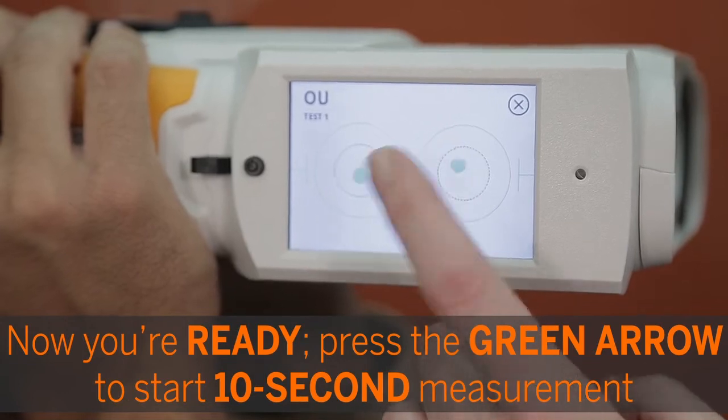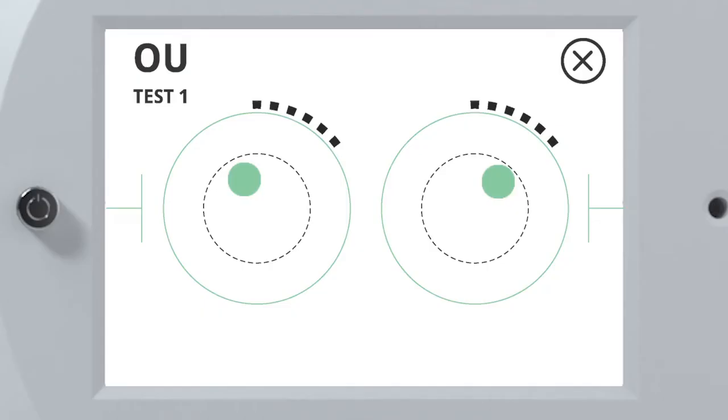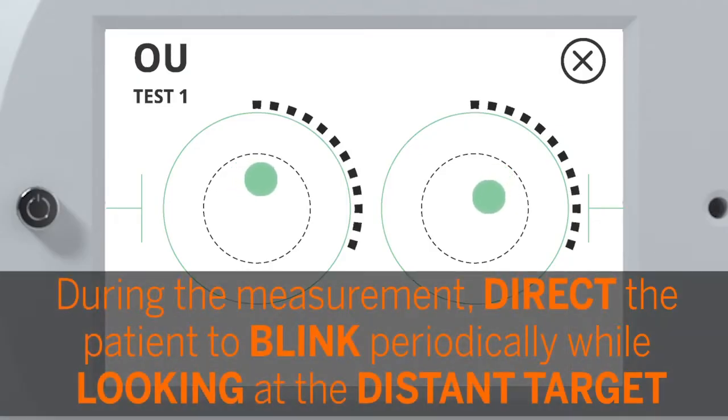Press the green arrow to start the 10-second measurement. During the measurement, direct the patient to blink periodically while looking at the distant target.